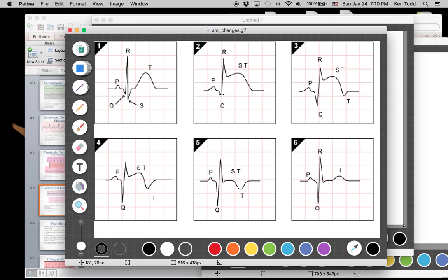So here you can see I have my P wave, my QRS, but my S doesn't even come all the way back down to my isoelectric line, and my ST segment is starting up here. So this is very significant ST elevation. This is commonly referred to as tombstoning, which is a very poor prognosis. It means you're having a massive MI if you're having ST elevations that high.